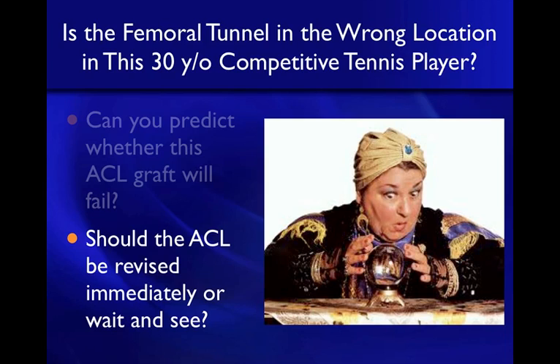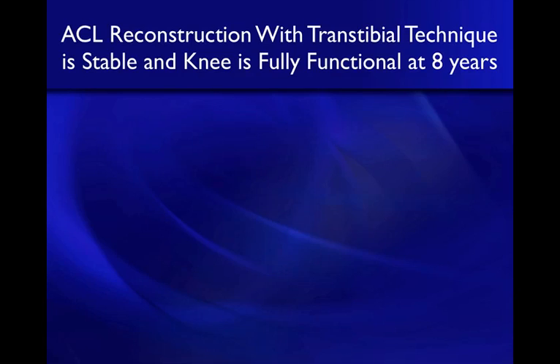Do you have the vision of a fortune teller? And should this ACL be revised immediately in order to let the patient get back to sport, or can we wait and see how it turns out? And to my surprise, this ACL reconstruction, which I perform with the transtibial technique, is stable and fully functional at 8 years.